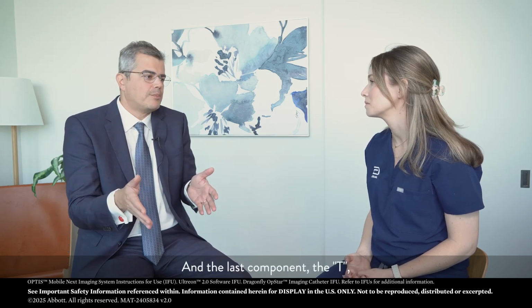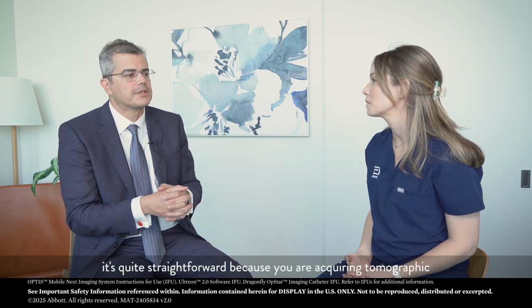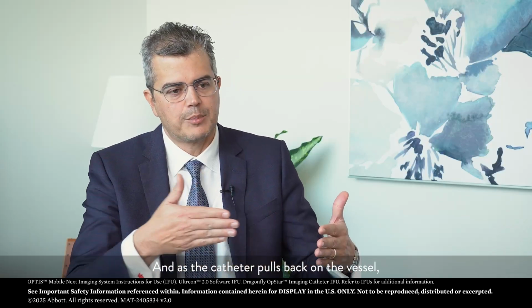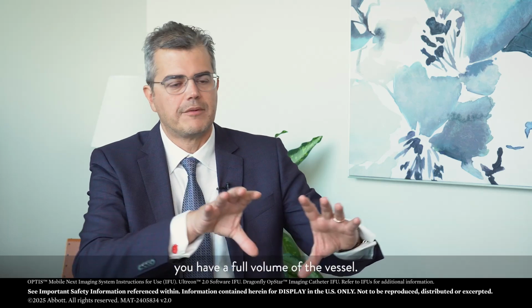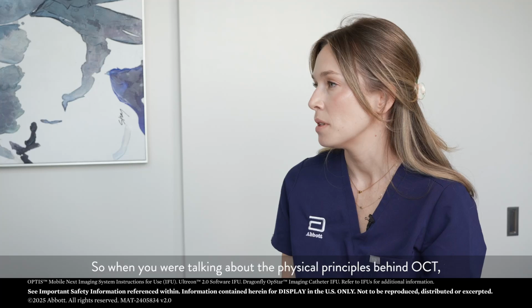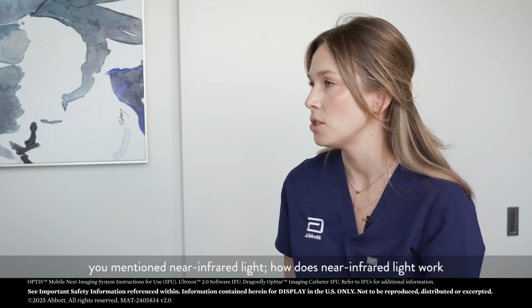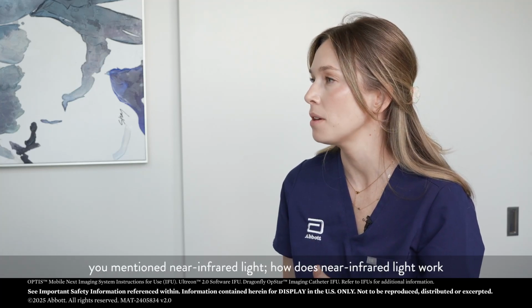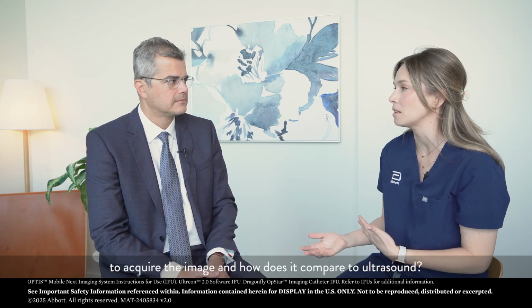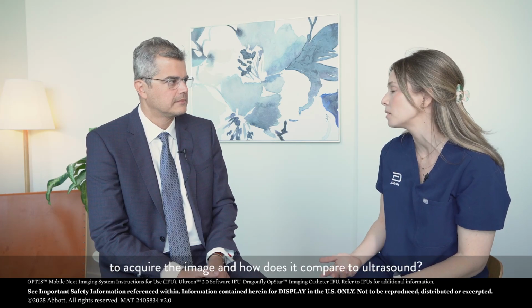And the last component, the T, is quite straightforward, because you are acquiring a tomographic image, or cross-sectional image, of the vessel. And as the catheter pulls back along the vessel, you have a full volume of the vessel. So when you were talking about the physical principles behind OCT, you mentioned near-infrared light. How does near-infrared light work to acquire the image, and how does it compare to ultrasound?